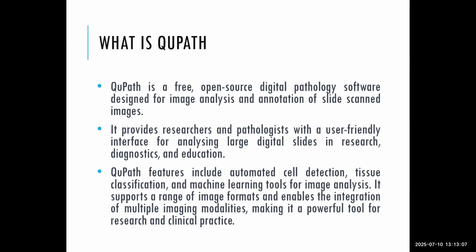It contains automatic cell detection, tissue classification, and machine learning tools for image analysis, and just like any good software, it supports a wide range of different imaging formats, because every time they bring out a new microscope, there always seems to be a different imaging format. And because it uses the Bio-Formats and OMERO functions, it can pretty much just open anything, which is great.